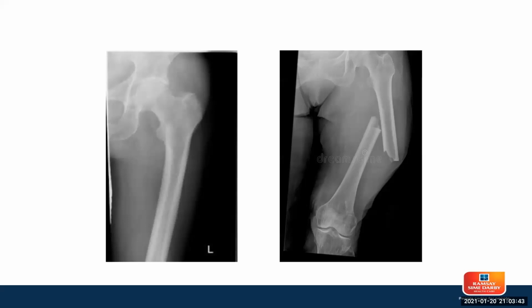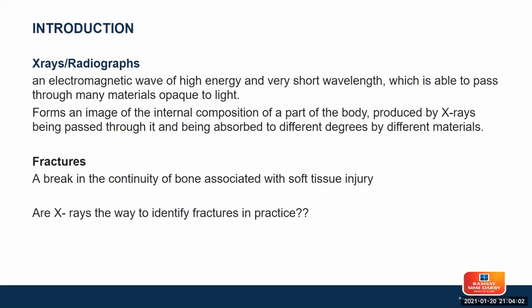A lot of times nowadays we communicate over the phone. You want to refer a case to another hospital, or you want to refer the case to your senior colleague. You need to describe it correctly because management can be different. The urgency of fractures can be different. So if you present it badly, then we're going to end up doing the wrong thing and managing the patient wrongly.